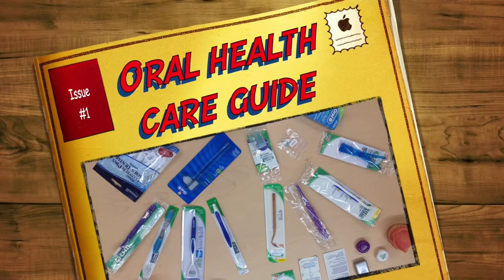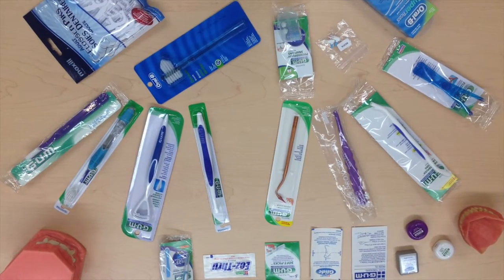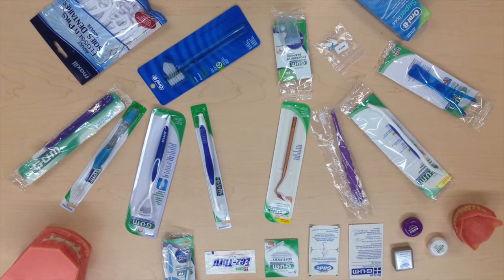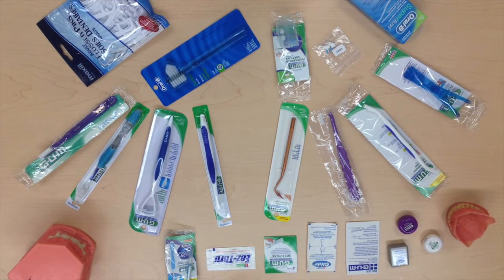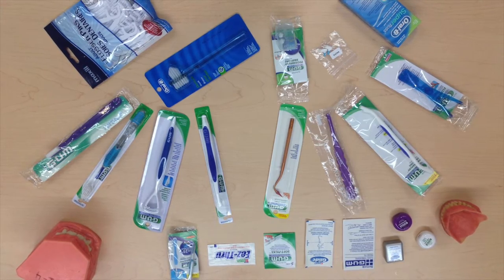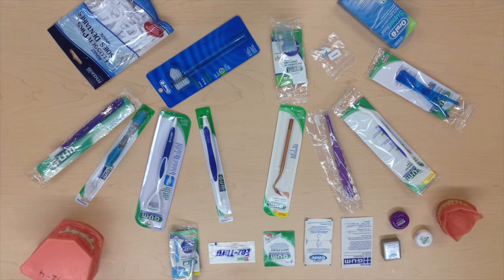The options available to consumers who seek oral healthcare tools may be very confusing due to the many options available. The objective of this video is to educate in regards to the uses of some of the more common instruments available on the market. Before we begin, we would like to impress upon the viewer that this video is purely for educational purposes and does not endorse any specific product brands.